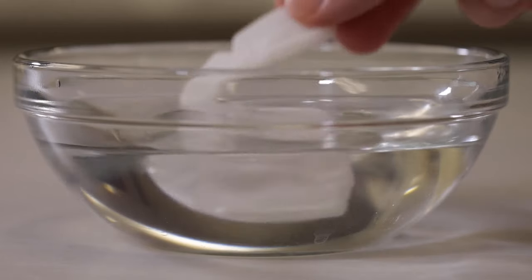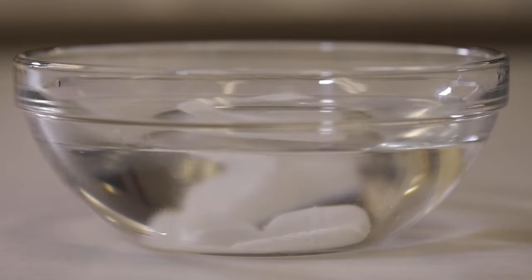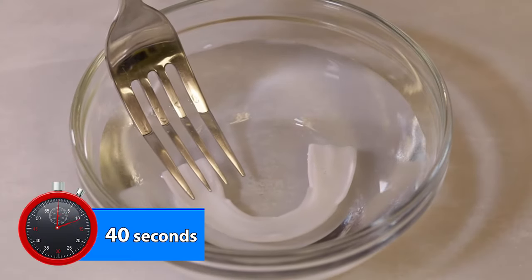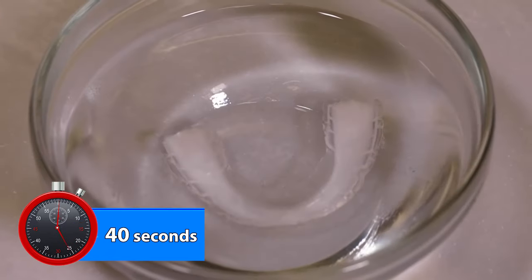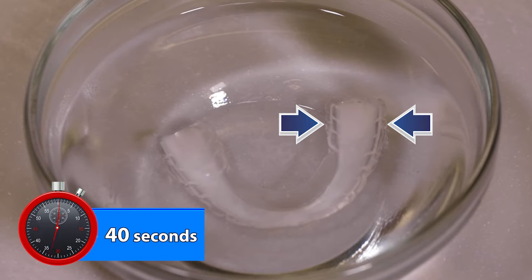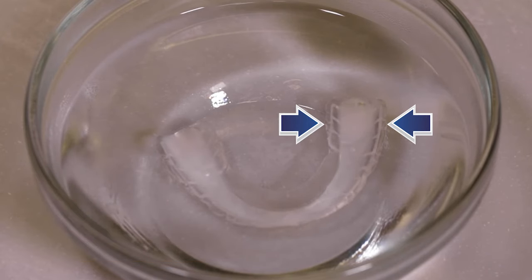Immediately remove the bowl from the microwave and submerge the dental guard in the hot water for about 40 seconds. If it floats, use the fork to push it down under water. The guard is ready when the outer edges turn clear and the white internal core is visible. If the outer edges do not turn clear, the water is not hot enough.